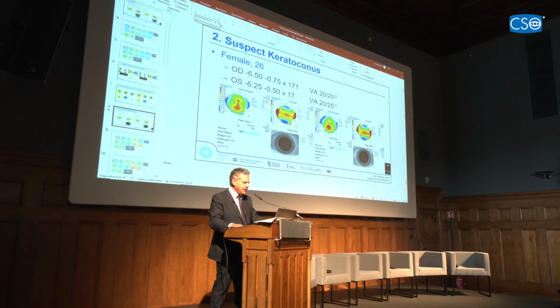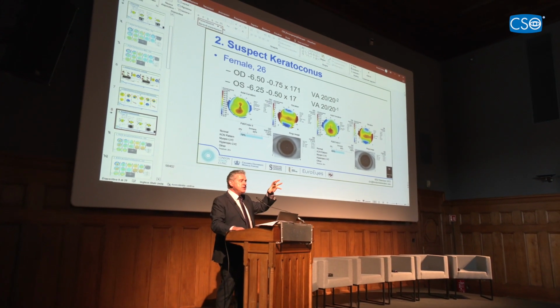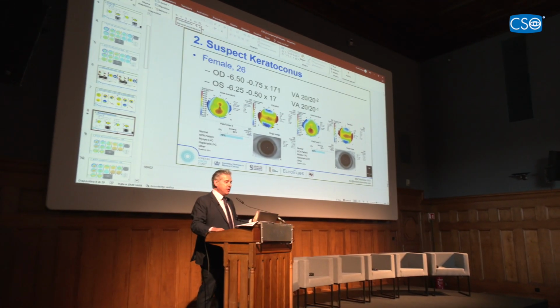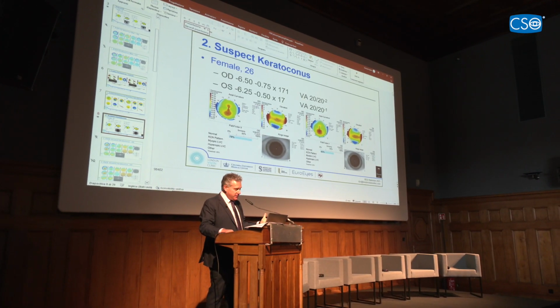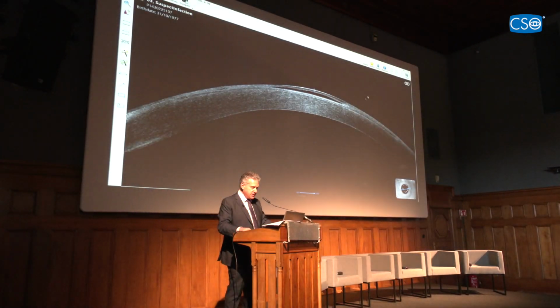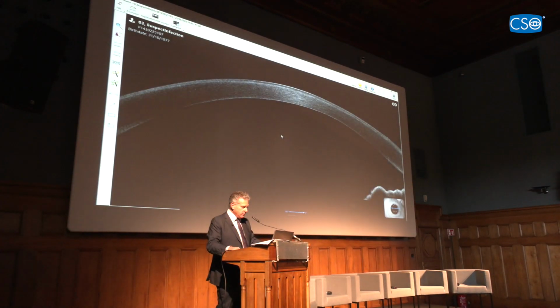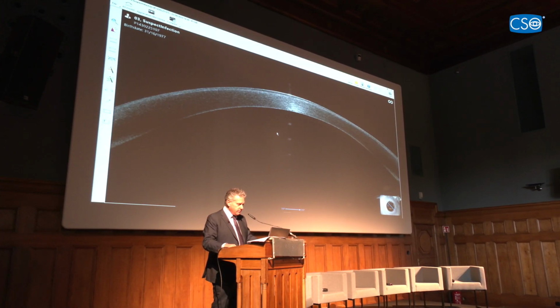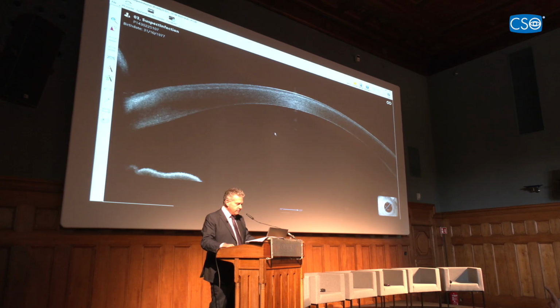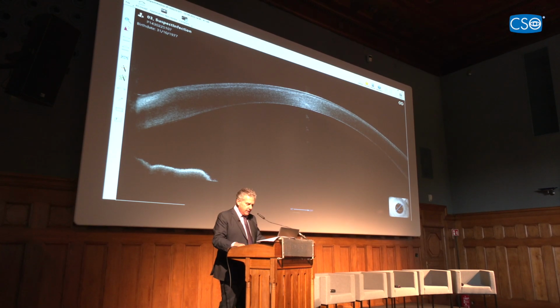I told her I don't think this is herpes, but I took it to the OR, removed all the epithelium, sent it for PCR, no problem, and then did a 25 micron PTK. And I just gave away my wow moment punchline, but this is what she looked like once she had healed. And that's the same cornea, right? Beautiful. This is a week later, right? Okay. And obviously, first time she hadn't had pain in 3 years. Okay, so, you know, nice case.